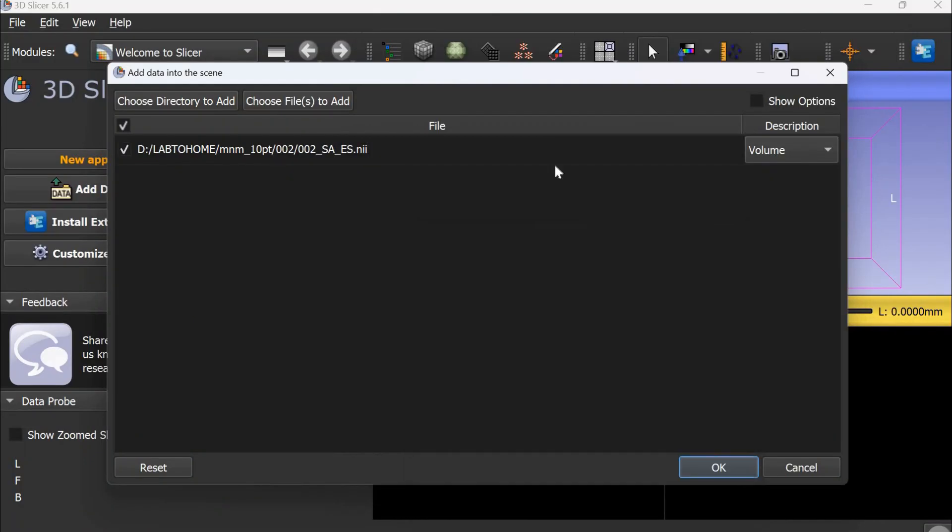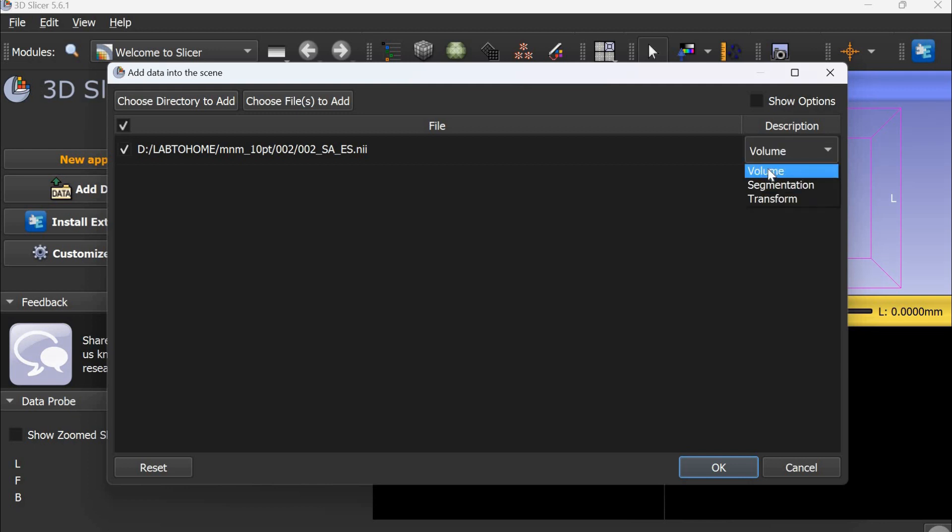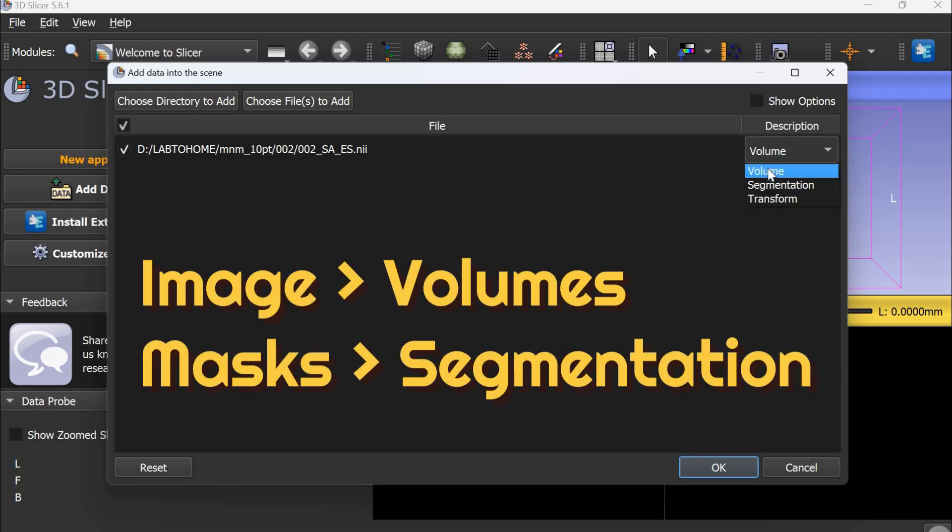After this, you have to tell Slicer whether this file is an image or mask. Since this is an image, we select volume. Now click OK.